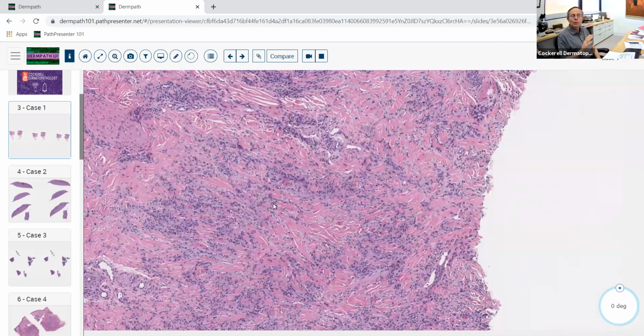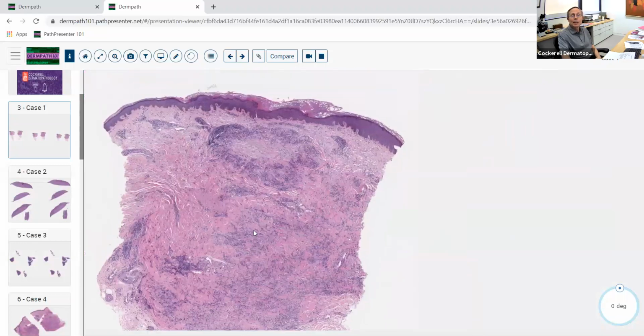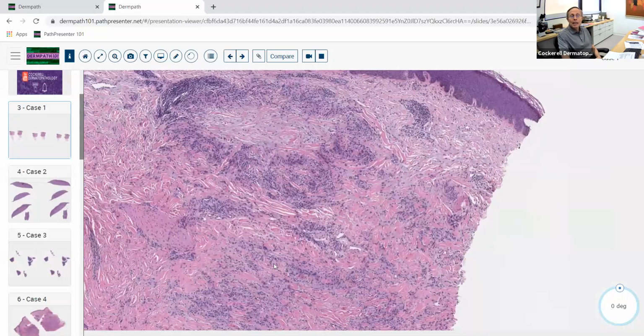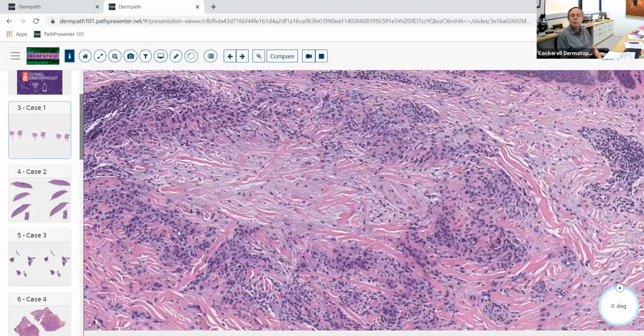So there are several different histologic and clinical subtypes of granuloma annulare. This is a classic example of that. Just a couple other pearls about GA. There are some simulators of it other than the typical palisaded granulomatous dermatitis. You always have to think about, at least briefly, the possibility of epithelioid sarcoma, which simulates GA.